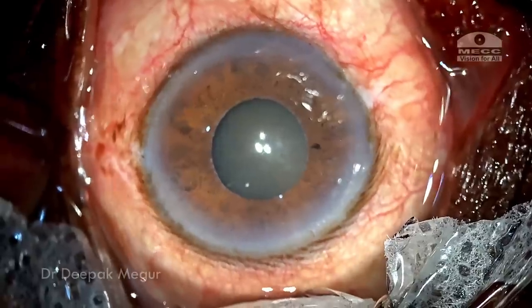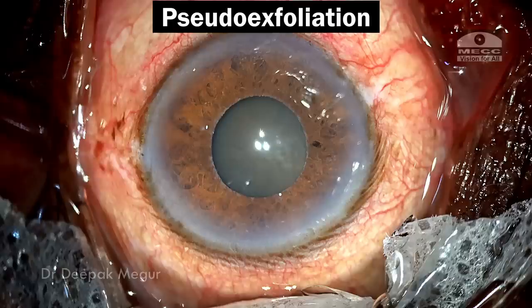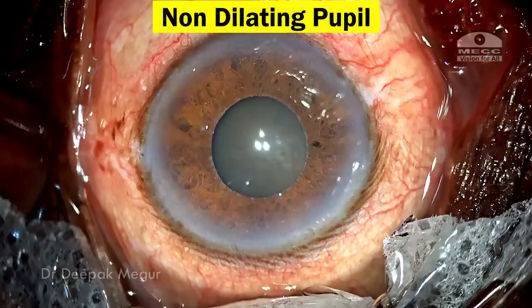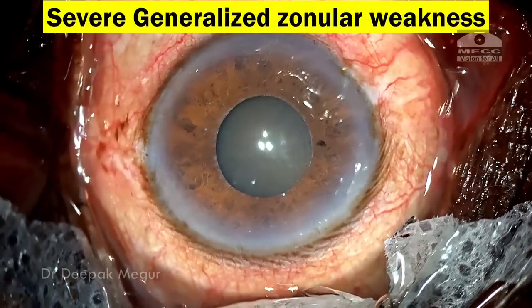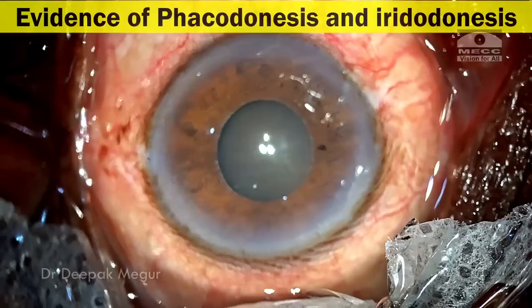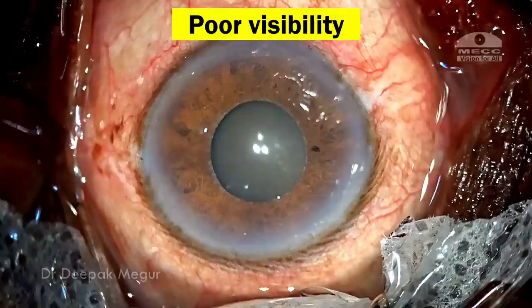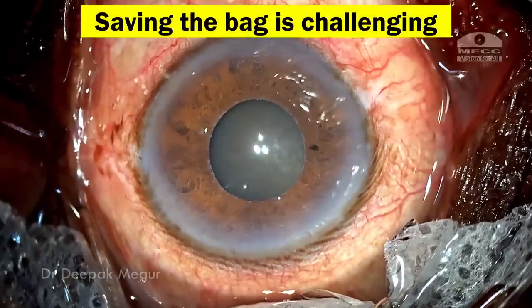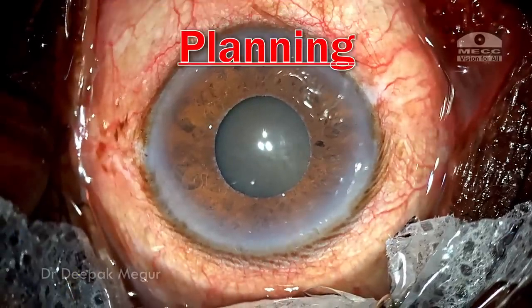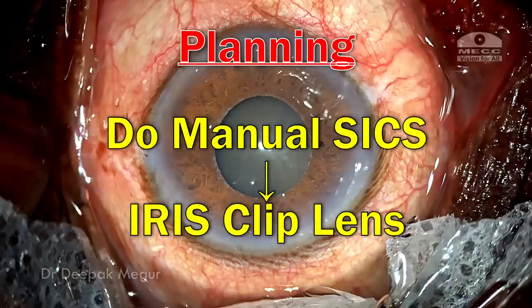Hi, I'm Dr. Deepak Magur and today we have this 85-year-old gentleman who has pseudo-exfoliation, a non-dilating pupil and a dense cataract. But the real challenge is he has got severe generalized zonular weakness, evident by the presence of phacodonesis and iridodonesis at the slit lamp. On clinical examination, it doesn't look like I can save the bag. My planning is to perform manual small incision cataract surgery with an iris clip lens fixation. Let's see how things turn out.